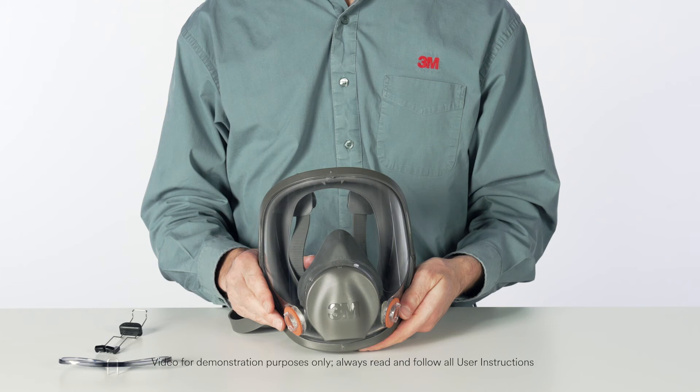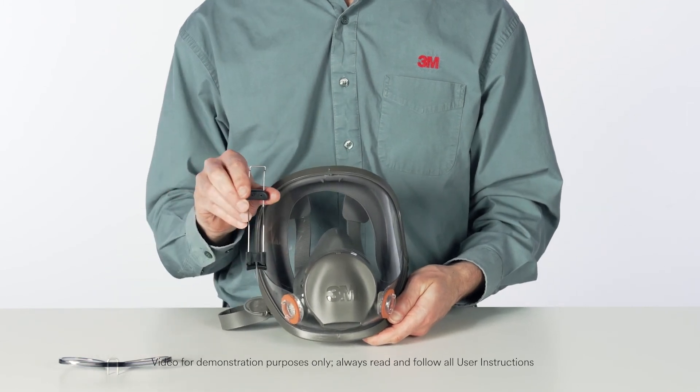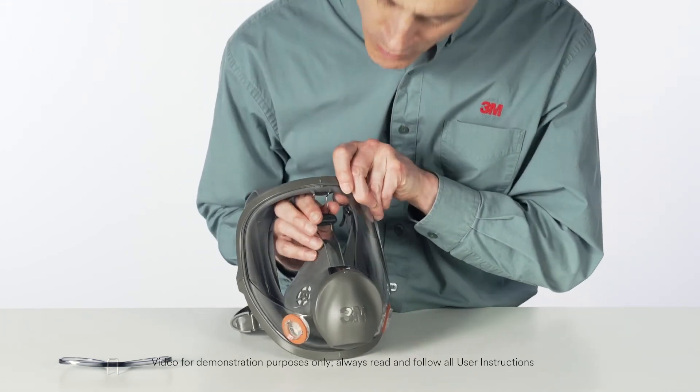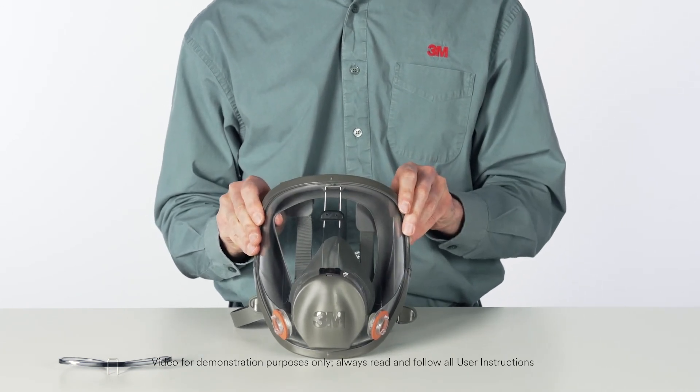The 3M 6878 Spectacle Kit consists of a frame assembly and a rail assembly. The frame assembly is the holder for the corrective lenses. The rail assembly supports the frame assembly in the facepiece and allows for up and down, in and out positioning of the frame assembly. To install the 6878 Spectacle Kit, install the rail assembly into the facepiece with the plastic foot positioned on the center port adapter. The slot-in foot is positioned over the ridge on the adapter.